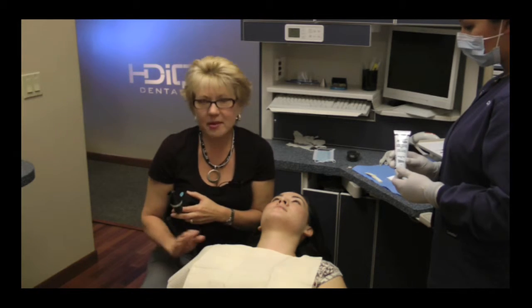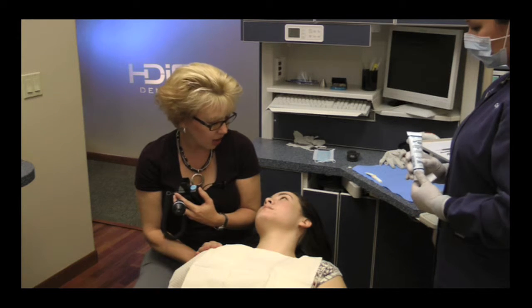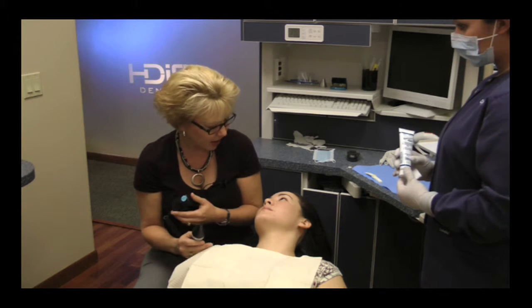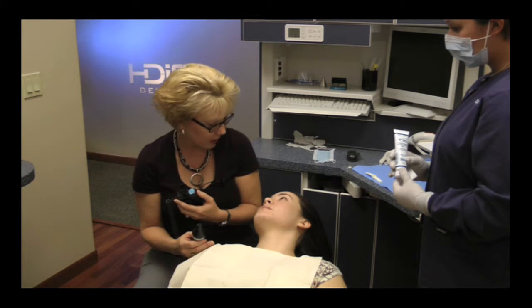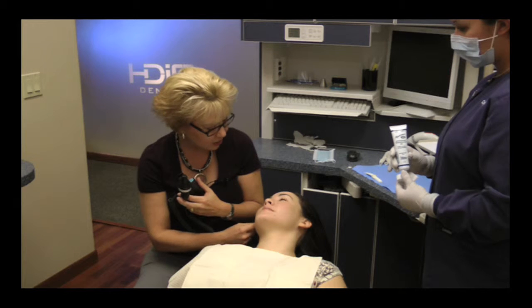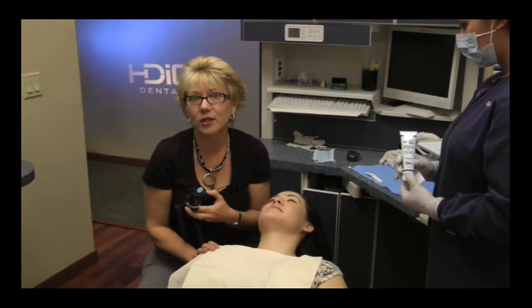The next thing I'm going to do is explain to Katie exactly what we're going to hear. So Katie, a normal healthy joint is going to be totally quiet under a Doppler. All you'll hear is this background noise. If we hear anything other than that background noise, then you and I will want to talk about what that means, what's going on inside your joint. Okay? We're actually going to put some jelly on this, just like they do when you have this done. If you want to hear a baby's heartbeat, then sometimes it's a little bit cold and it will definitely be a little bit messy. I'll try to get your hair out of the way as much as possible. So now she knows what we're going to do.